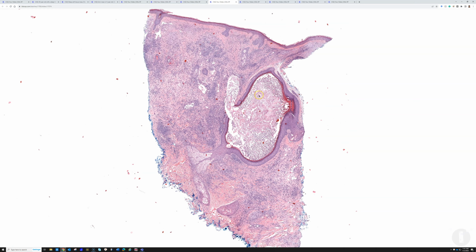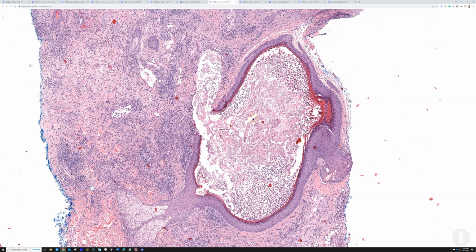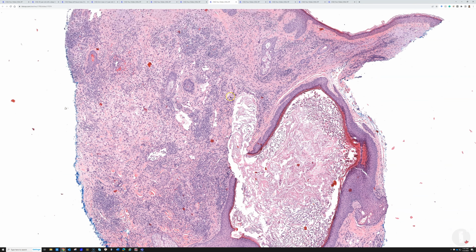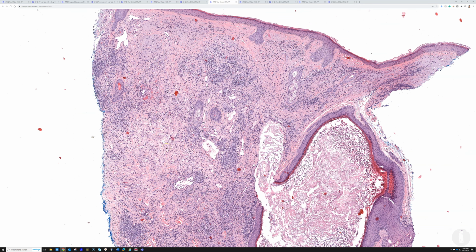Because there is a ruptured cyst here. Okay, they wanted a ruptured cyst clinically. Microscopically, we see an obvious cyst or a cystic hair follicle, same thing, that has ruptured and spilled its keratin, and then there's a bunch of inflammation around it, right? Well, you know I would not be showing you something like a ruptured cyst unless there was more to the story.